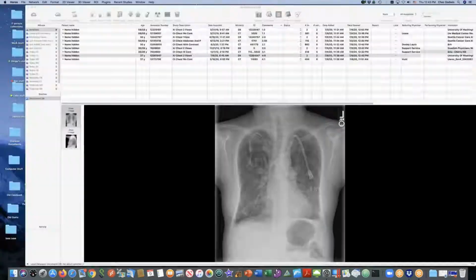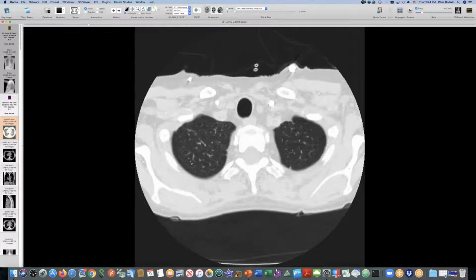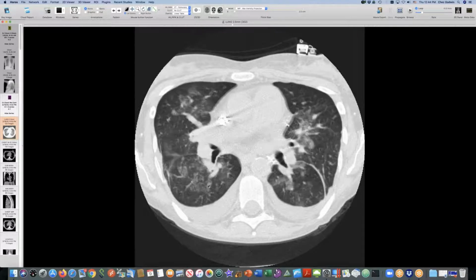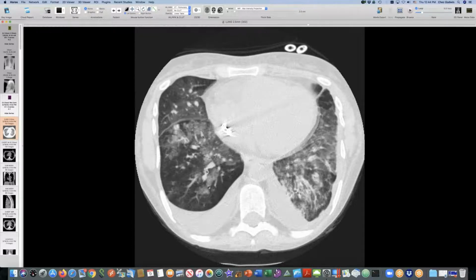So then I wanted to show you this fellow who had a transplant, not done at our place, back in 2007, and developed chronic renal failure. He has this dialysis catheter in place. And then he had these progressive lung nodules that are mostly in the right upper lobe. And if we look at those on CT, we see a sort of cauliflower-like ground glass abnormality. I'd like to show you some of the cauliflower aspects of that better down here.